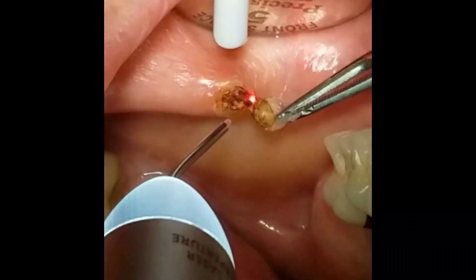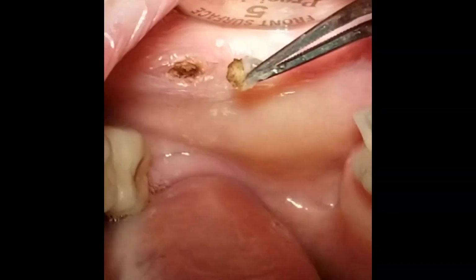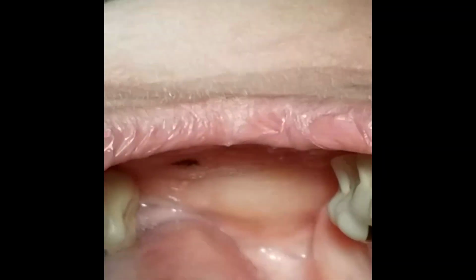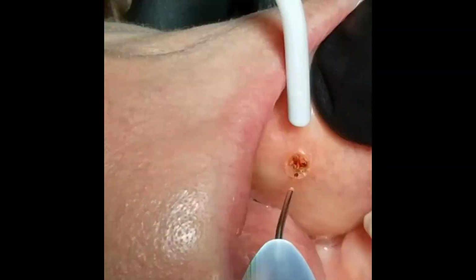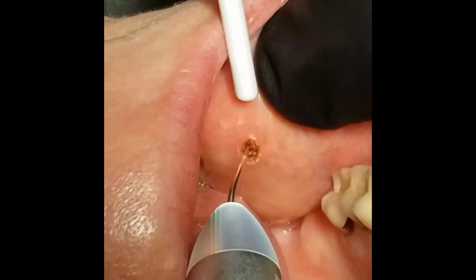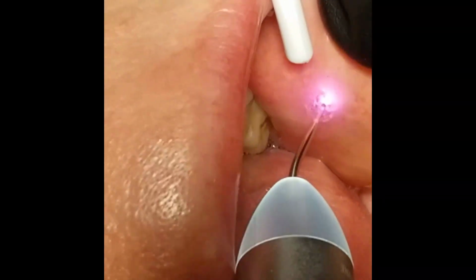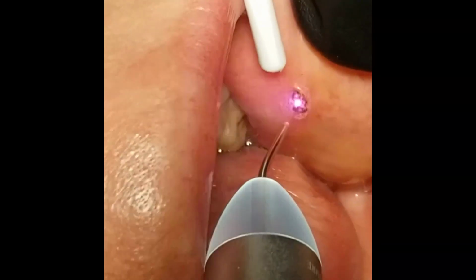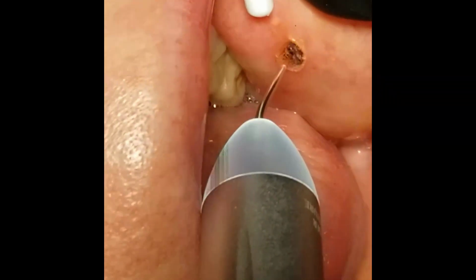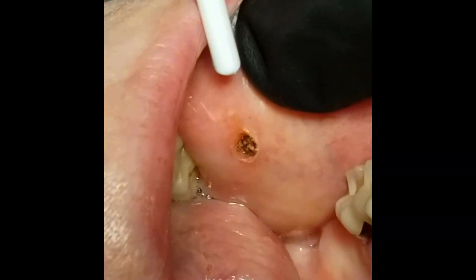See, we're almost at the end. You'll see how easily we eliminate that fibroma. And the soft tissue is totally intact. There's no bleeding. I see a little extra fibrous tissue here at that base, so I'm going to go at it just to make sure we don't get regrowth of that. Kind of scar that wound a little bit. Again, we're not going to get any bleeding. I'm just going to remove any residual fibers that could be there. And that's the end of our procedure.